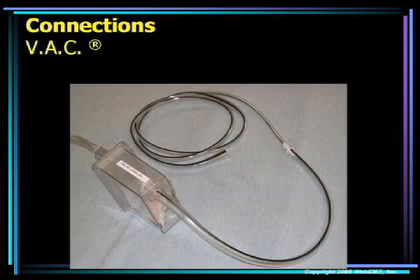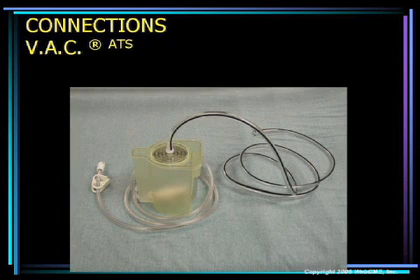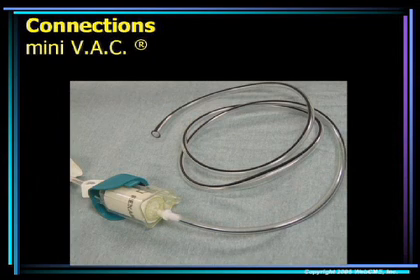We have found several adapters to connect to the various canisters used by KCI for their suction devices. For the original VAC, it's simply a piece of Argyle bubble tubing cut at its widest point, which allows us to connect to the male connection on the VAC canister. For the VAC ATS, we use a respiratory fitting for connecting oxygen tubing, which fits the opening in the top of the VAC ATS canister. The same connection used for the VAC ATS also fits the Mini VAC. The VAC Freedom has a smaller opening and requires a different connector.